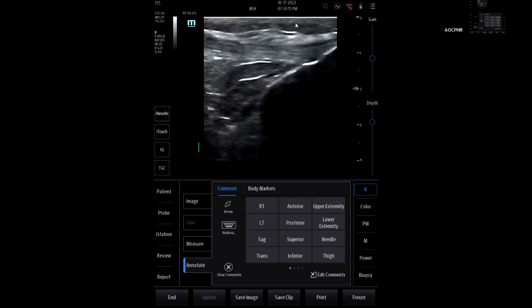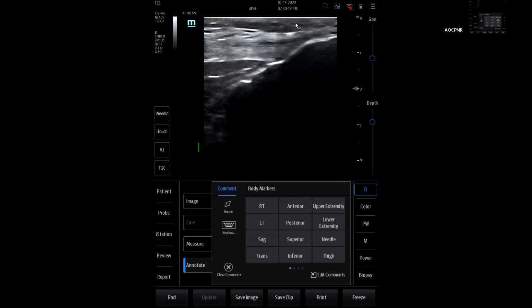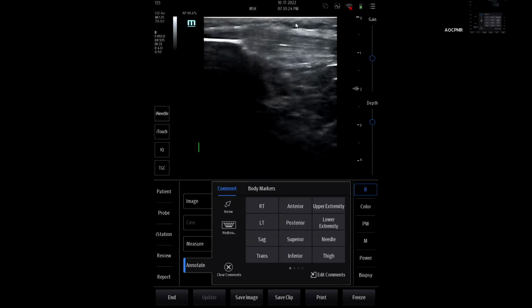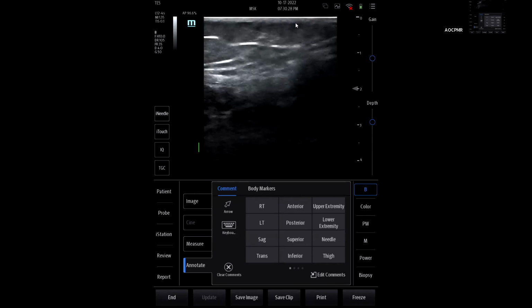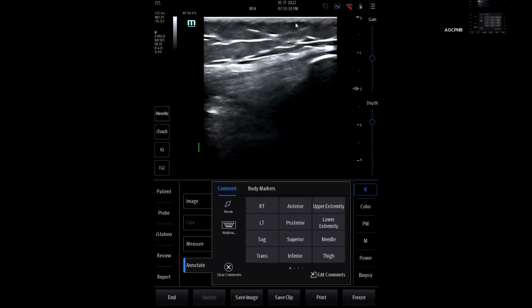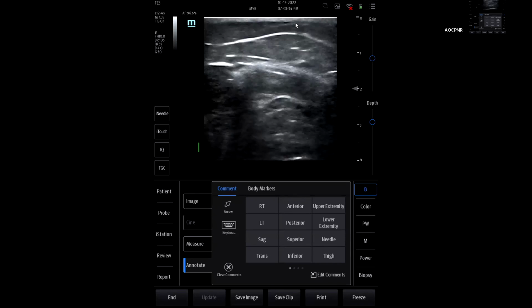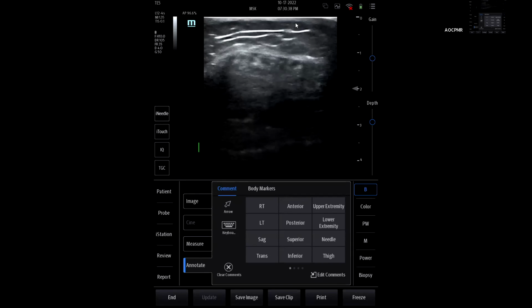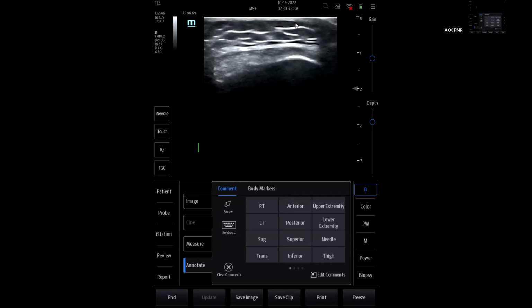Can you contract one more time? And you see, it's not quite as big as the quadriceps tendon. It's not supposed to be. Going straight across this way. Up over top, moving superiorly over top the patella again, and this way to the quadriceps. We can always turn it in short axis this way. So I'll start on the patella and move superiorly, and look at the fibers of the quadriceps tendon. So here's our quad tendon.